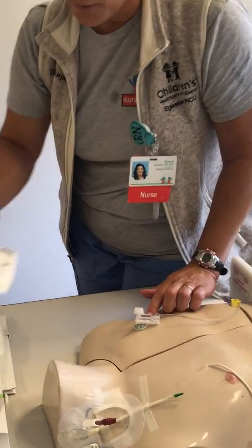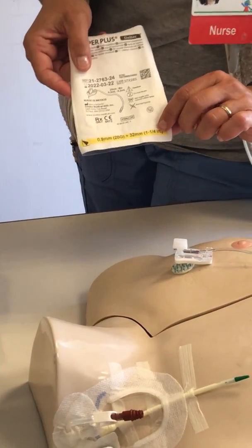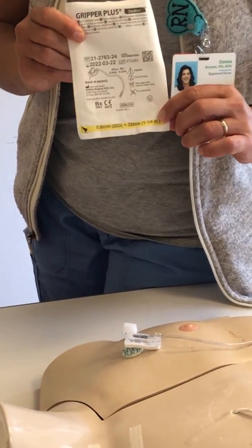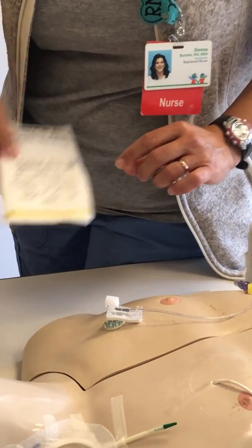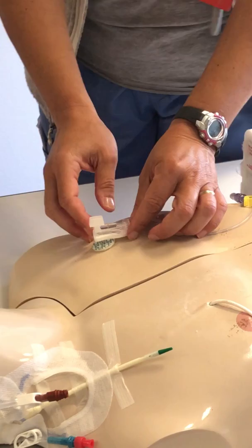I've picked up the wrong needle. It's not very stable. It's too long. I accidentally, in the Pyxis, unfortunately, we have a bin that says maybe 20 gauge, 1 inch, but they're not always right. And I accidentally picked up the wrong one and now it's too big. So what we can do is we really don't want to de-access this port for this kid. You just make him more upset.